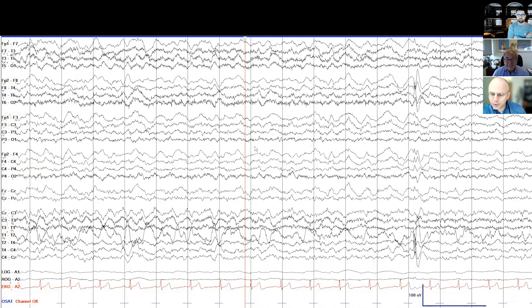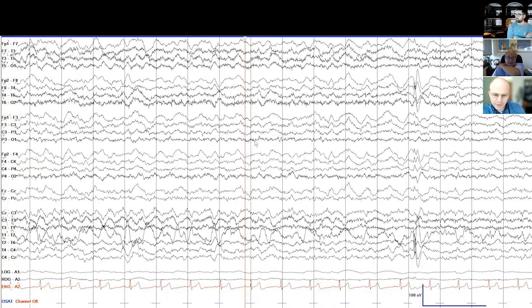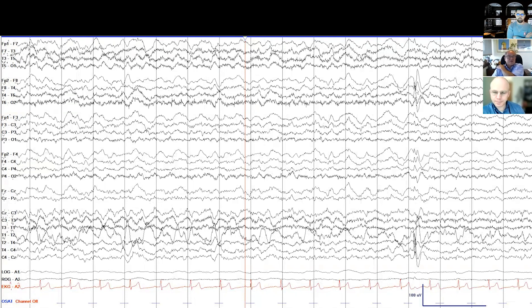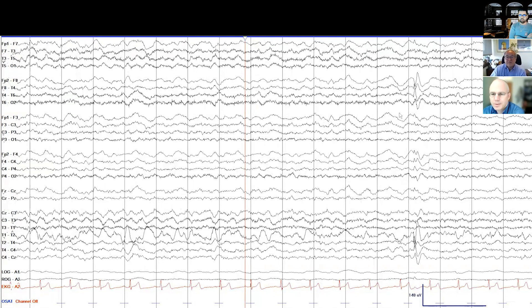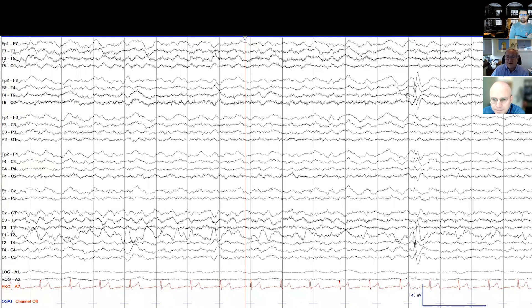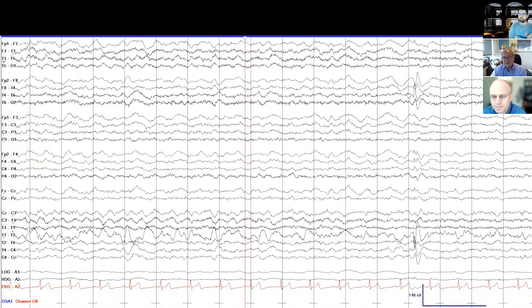It seems pretty clear that they're temporal or anterior sylvian. Here you see a phase reversal, probably at F8. Make the amplitude a little lower so you can see that there's equal potentiality across F8-T4 here and F8, or F7 on the other side.